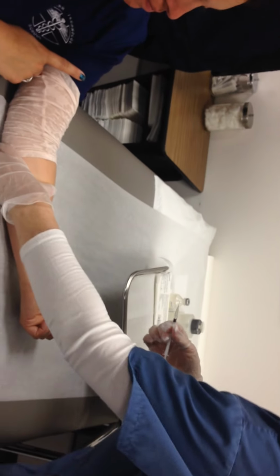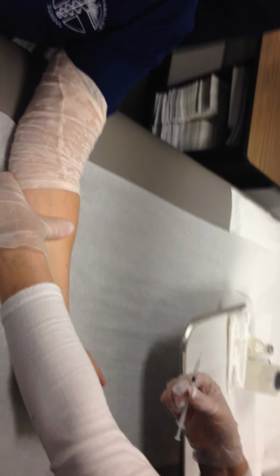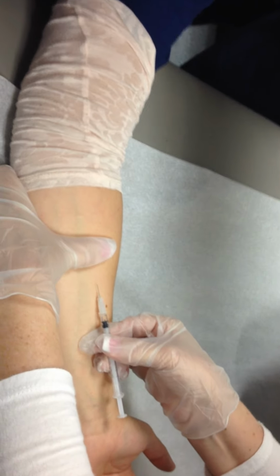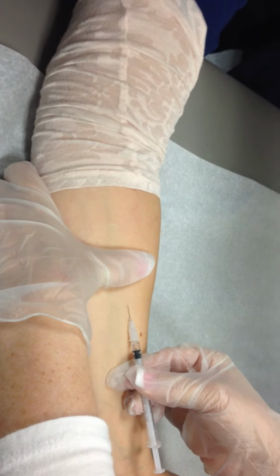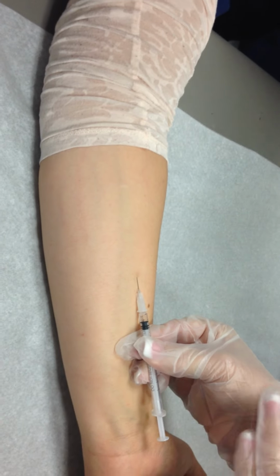I'm going to come right over here. Can everybody see? Come in if you can. We're gonna be on YouTube. I'm going to pull this nice and tight. You see that? Now I'm going to come here, and I'm at a 10-degree angle. This is intradermal. And I'm going to go right under that first layer of skin until that bevel disappears. Do you see it? It's gone. Do you see how it's gone? Okay. And you're going to come around. See how my right hand stays steady? I don't move the right hand.